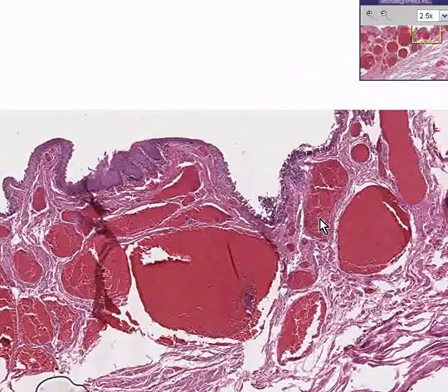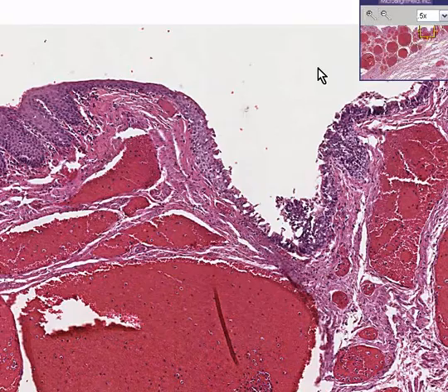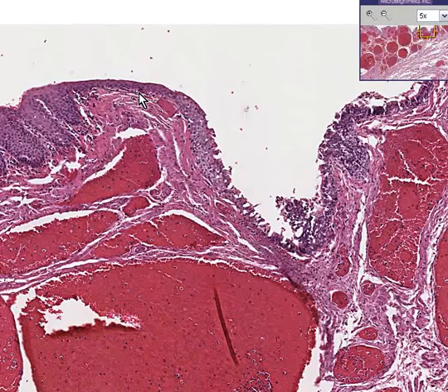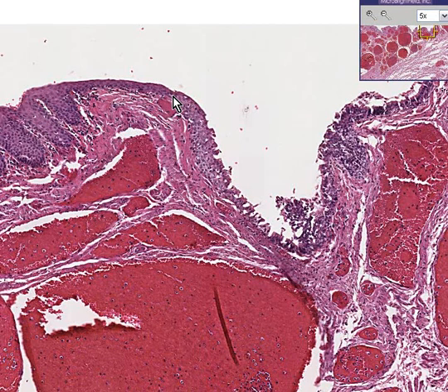The transition between the columnar mucosa and the squamous mucosa is another squamo-columnar junction in our body called the pectinate line.